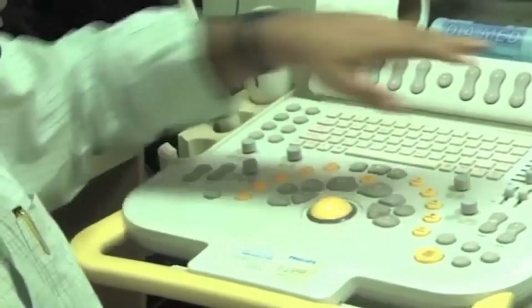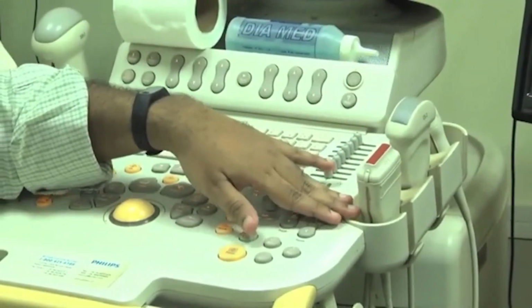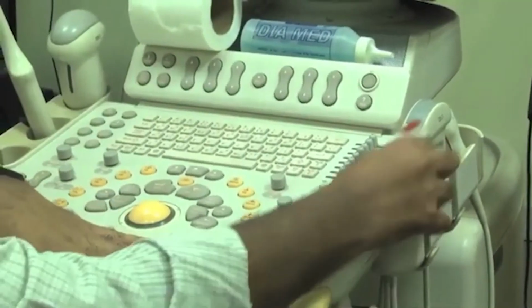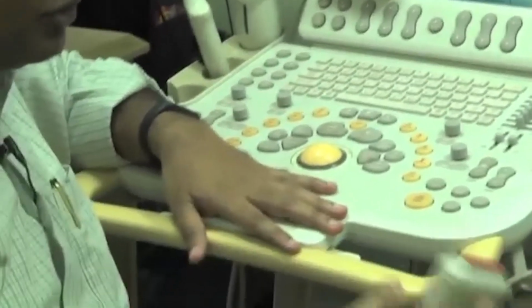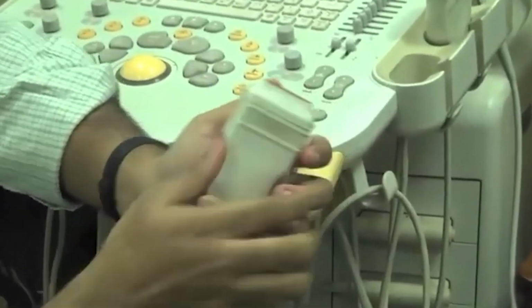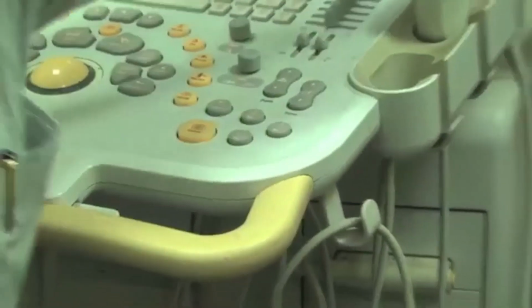Now as for the rest of the things, you would see that there are 3 probes over here which we are going to use, and they are pretty similar to the ones you have seen on the presentation. The first probe I have is a linear probe. If you look carefully over here, there is a marker, and this marking is basically my left reference, similar to the circle you see on the screen.